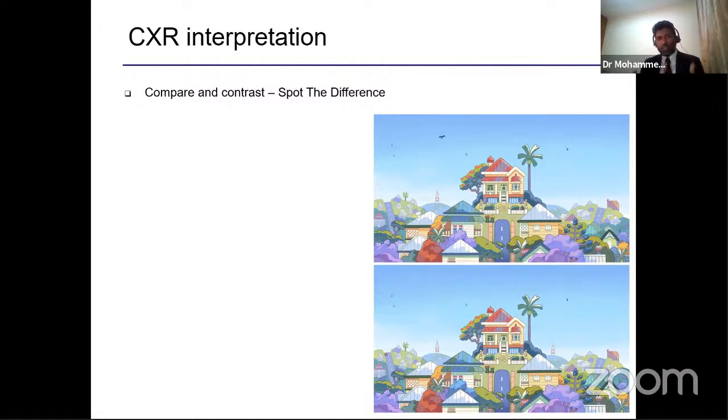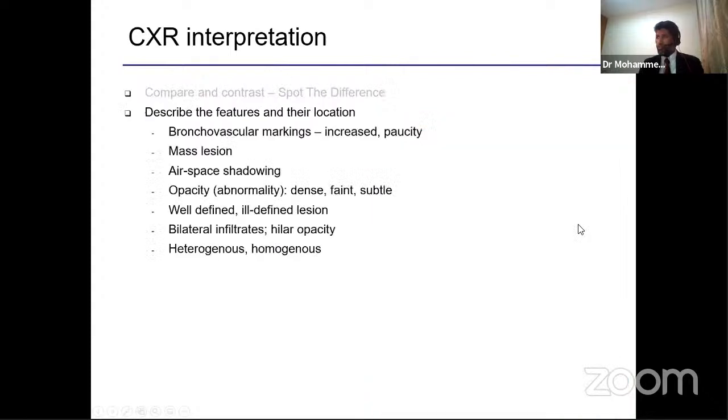If there are some changes which are chronic, which are persistent, they're less likely to be infective, they're less likely to be acute inflammatory, or less likely to be malignant. Whereas changes which acutely evolve or within a few days are more likely to be infective or mechanical or inflammation. And on the other hand, when things start to slowly increase or change over time, probably over weeks or months, we ought to think about malignancy as a possible underlying cause for the changes.